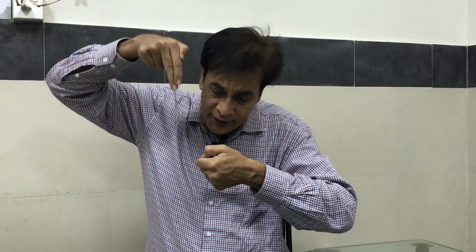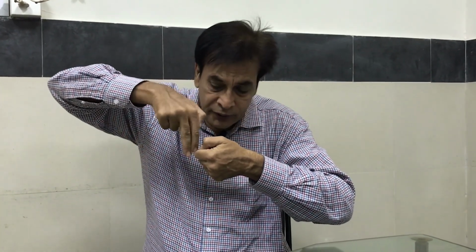Then you will insert the tip of the straight artery forceps in the incision, and then you will open the straight artery forceps. So the tonsil tissue would be separated from the bed, and then you will take a very small gauze piece and insert that gauze piece inside the incision. The best dissection is the gauze dissection.